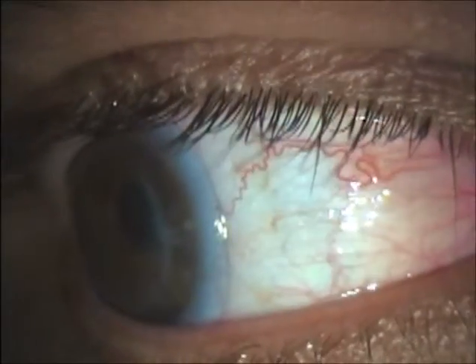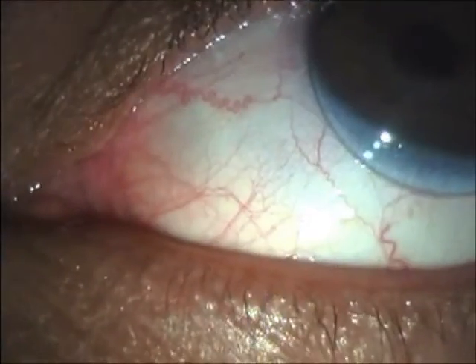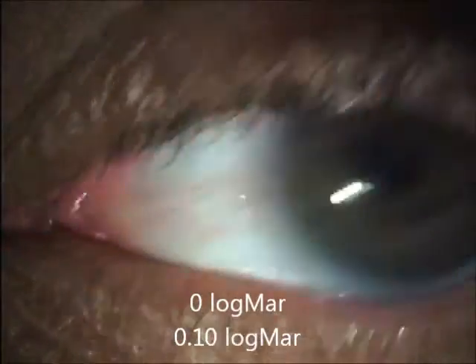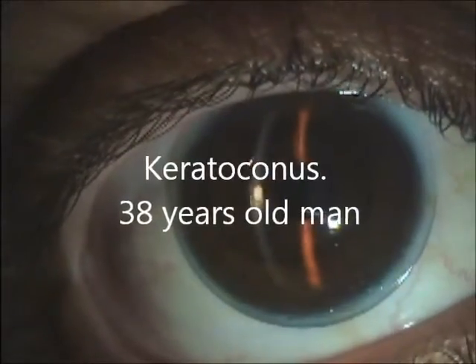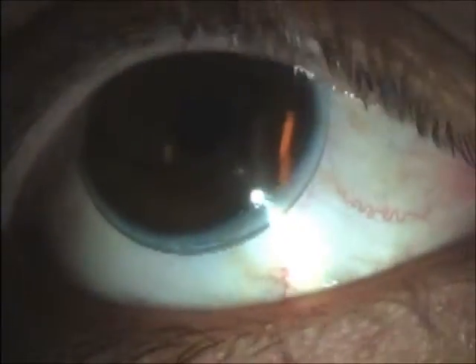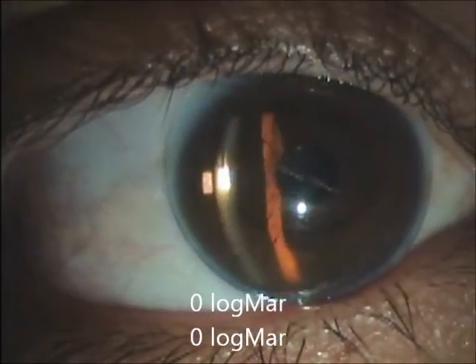This is another adaptation in a patient with corneal transplant in both eyes. In this case of keratoconus, a topography-based adaptation is easier and faster.